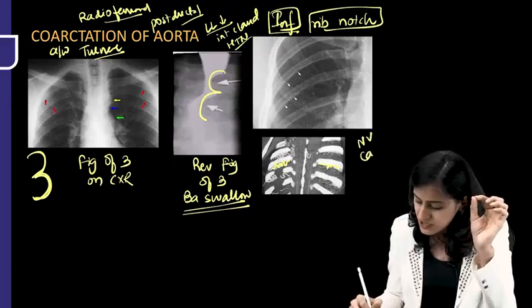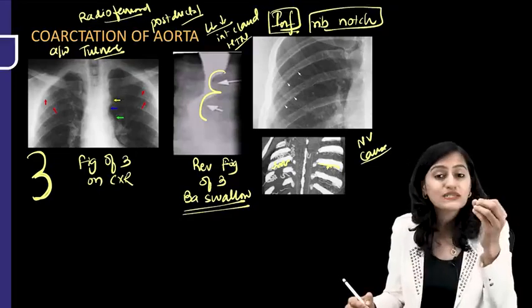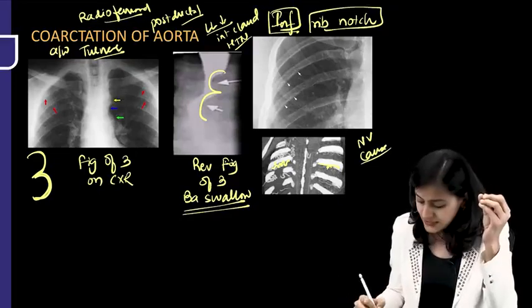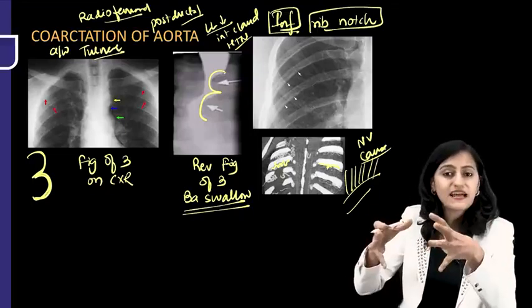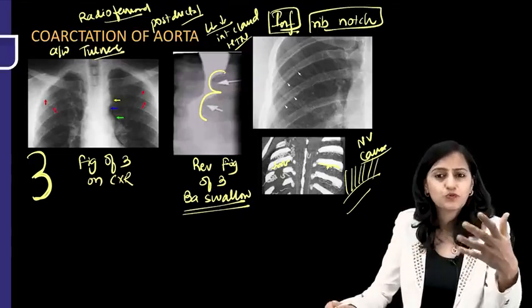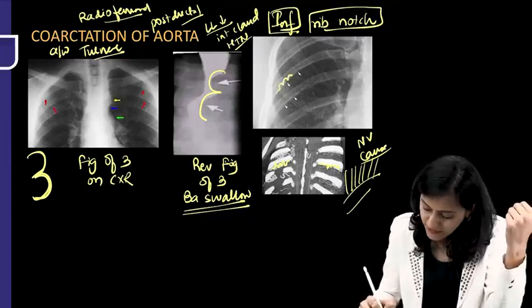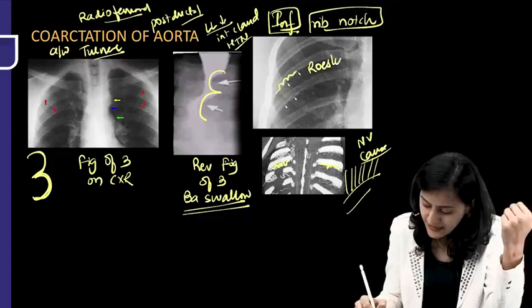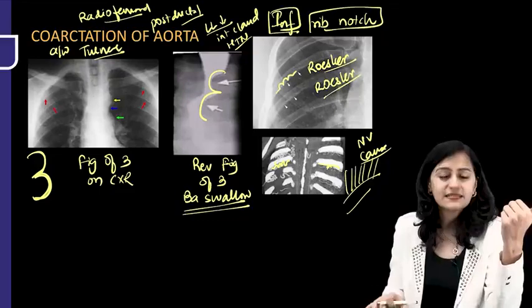So basically any neurovascular cause like neurofibroma, AV shunt, that would cause inferior rib notching. Superior rib notching will be the muscular causes. Muscle attachment there, so connective tissue disorders, polio, rickets will cause superior rib notching. Right? So look at this inferior rib notching, which is also called Roesler's sign. Okay, this is also called Roesler's sign.